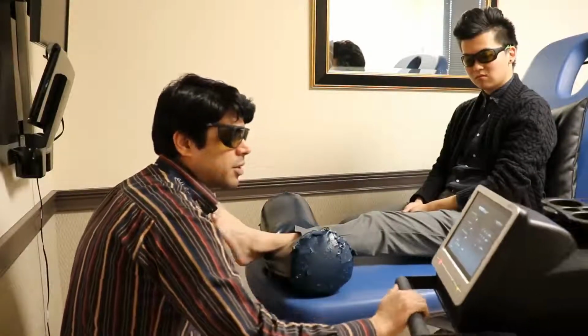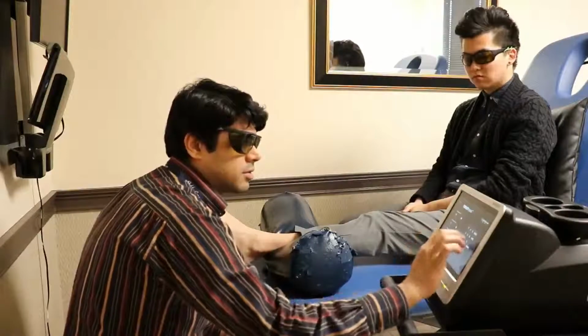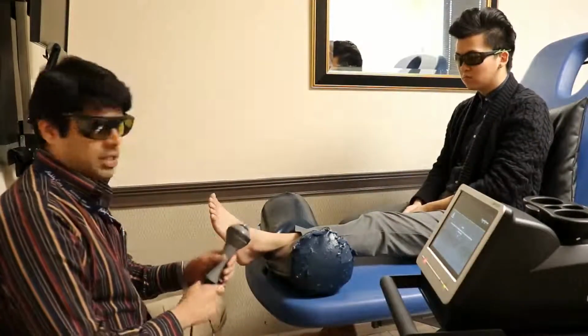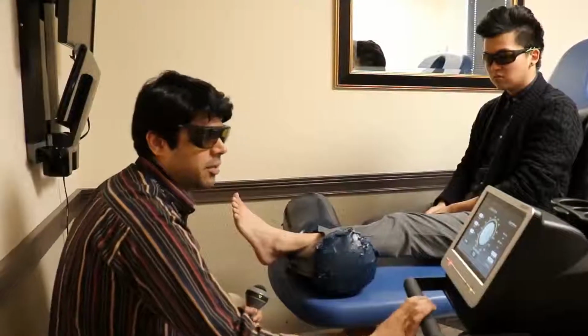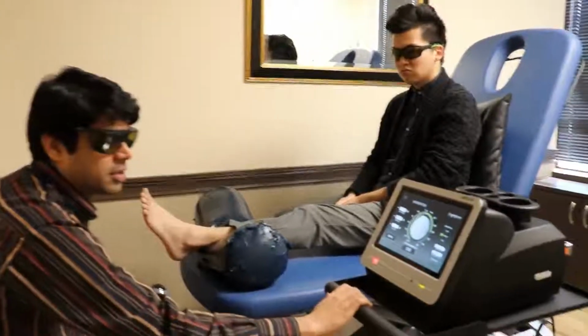I'm just gonna set up this real quick. It takes not very long. Still 20 here as well. So we just have to put the area in. We just have to see how much energy we want, and the machine will do all the calculation, setting up everything. So as you can see here, it's going to give him 6,000 joules of energy.